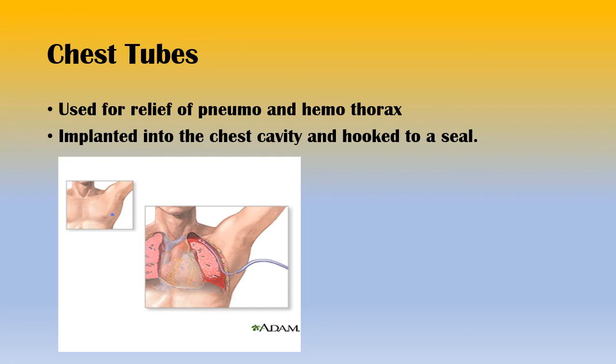The big thing with C3, at least right now until the update comes out, is that chest tube must be clamped off. You can't have it hooked to anything during transport. Long story short, when it's hooked to something, it requires a little bit of suctioning to maintain that seal. So right now, they don't want you to mess with that. The chest tube can be in there and in place. It just has to be clamped off at the end.